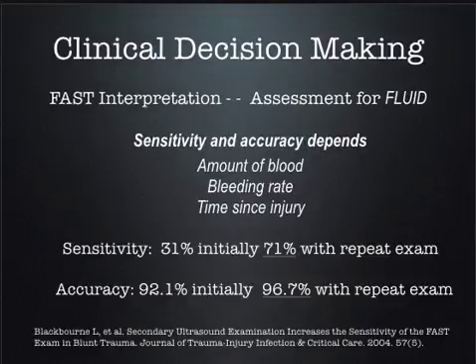It also has to be a certain amount of blood before you can see it. So if somebody gets to the hospital really fast, let's say they get hit on 15th Street and EMS is right there and they bring them right into the trauma room, and they've got a huge liver laceration and it's bleeding a lot, they may have gotten there so quickly that there's not enough blood for us to pick up. So it takes some blood in the abdomen before you pick it up.